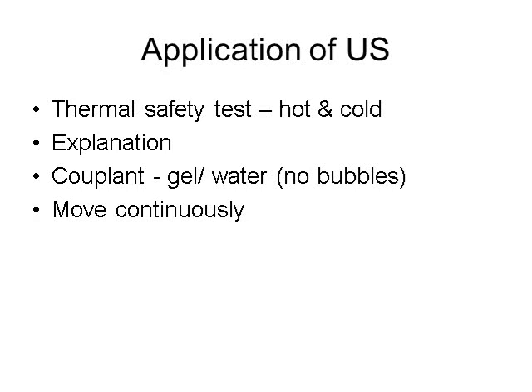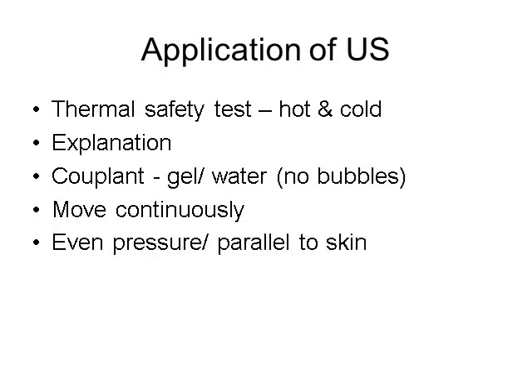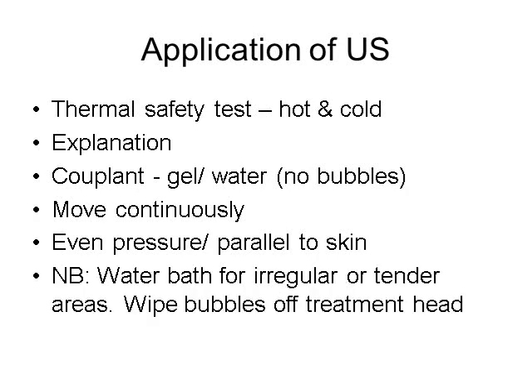You should move the treatment head continuously during treatment and use an even pressure with the treatment head parallel to the skin surface. Application using a water bath is particularly helpful for irregular or tender areas such as joints of the hand and fingers. You should regularly wipe bubbles off the treatment head.